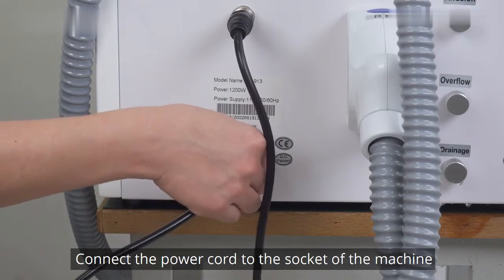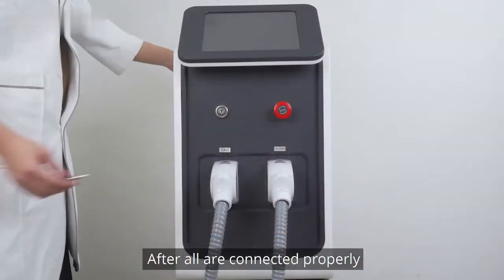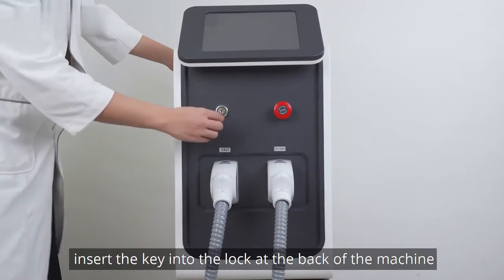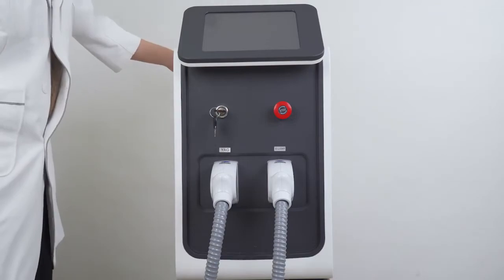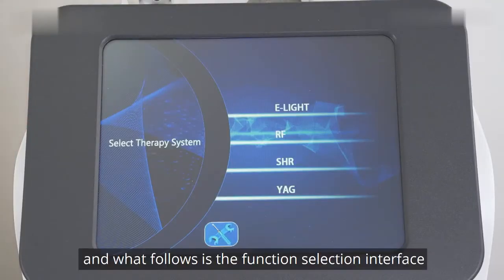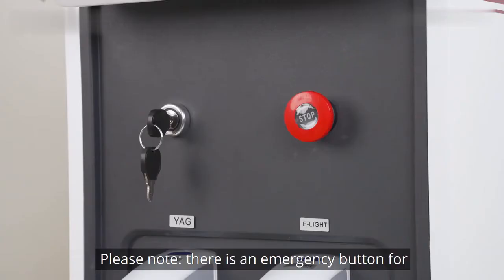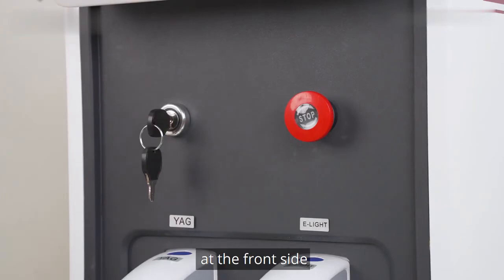Connect the power cord to the socket of the machine. After all connections are properly made, insert the key into the lock at the back of the machine and turn it to start the machine. The welcome interface will appear, followed by the function selection interface. Note there is an emergency button for turning off the machine at the front side.